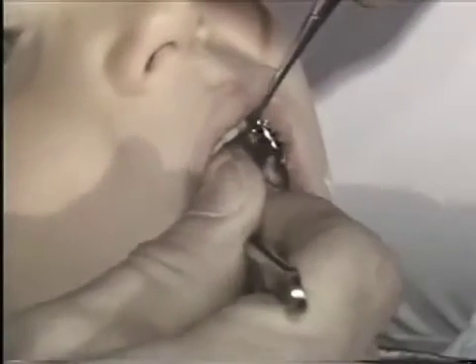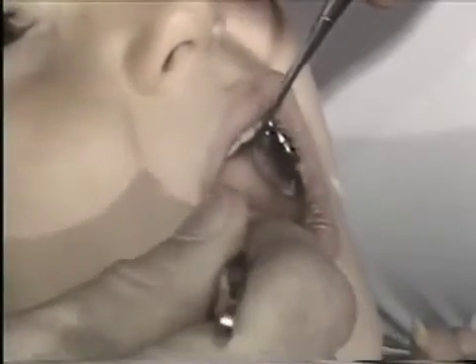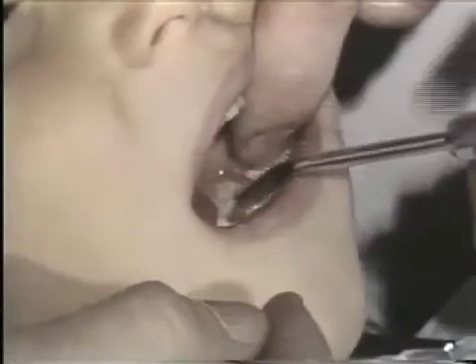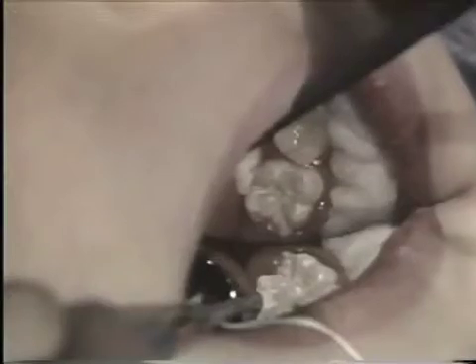A cotton roll is placed in the lingual fold area under the tongue so the tongue rests on top of it, removing the tongue from the field as much as possible. A second cotton roll is placed loosely in the buccal fold, nestling the partially erupted tooth between the two cotton rolls for as well-isolated a field as possible. We recognize that the operculum of tissue represents the area most likely to present difficulty in isolation and possible contamination of that distal surface. The alternative is to wait longer in the eruption sequence for a better result, but at the risk of decay developing in the interim.